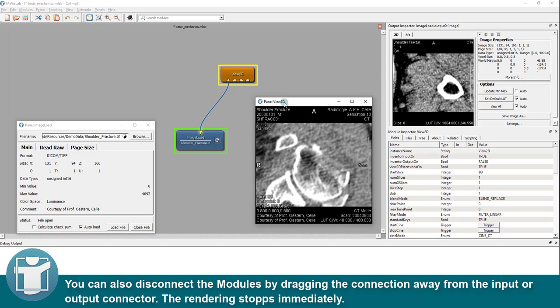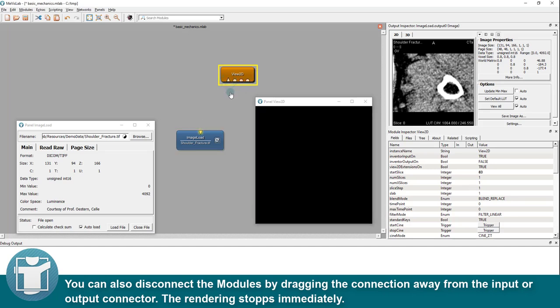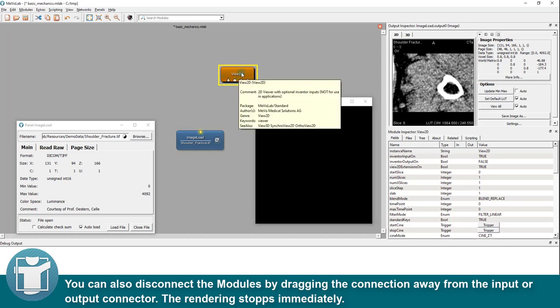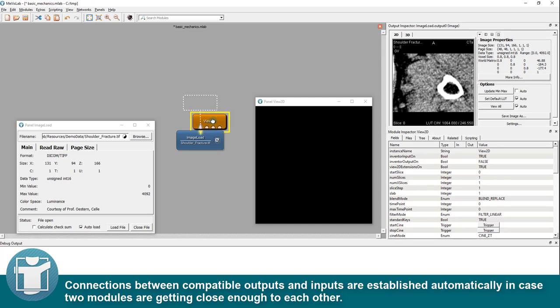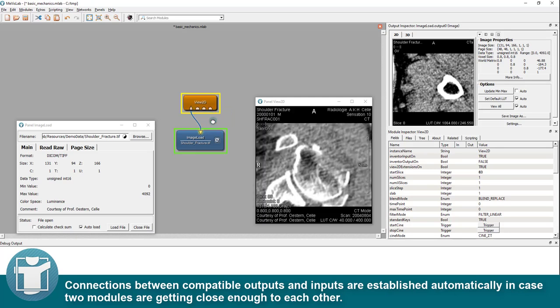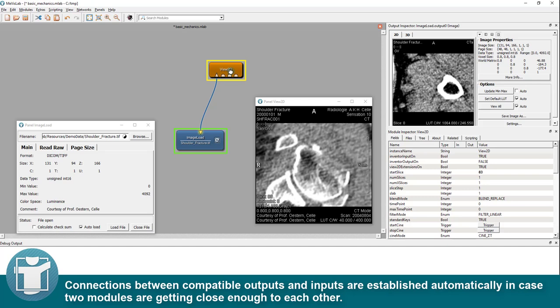You can also disconnect the modules by dragging the connection away from the input or output connector. The rendering stops immediately. Connections between compatible outputs and inputs are established automatically in case two modules are getting close enough to each other.